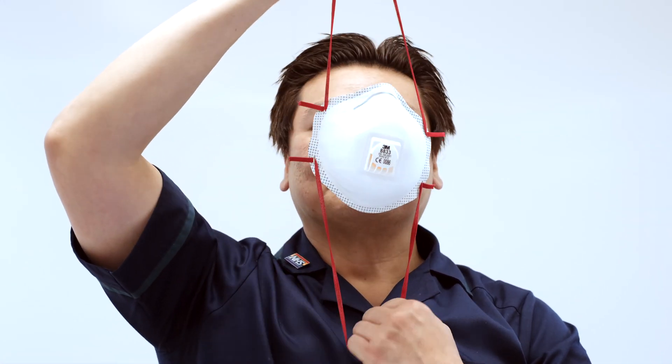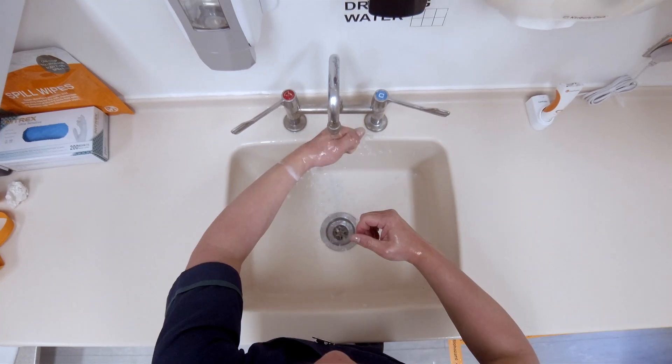Lastly, remove your FFP3 mask. Do not touch the front of the mask. Dispose of it properly and perform hand hygiene.